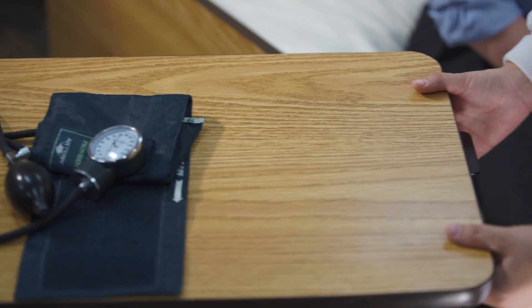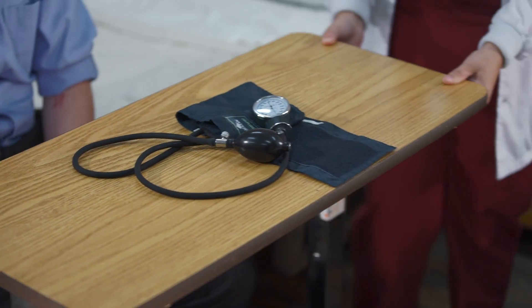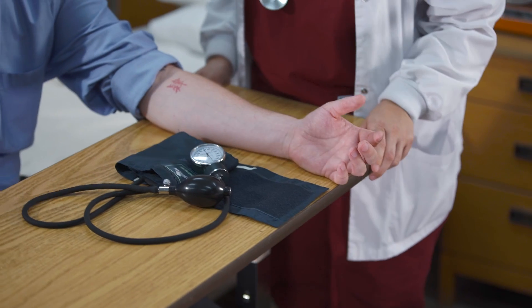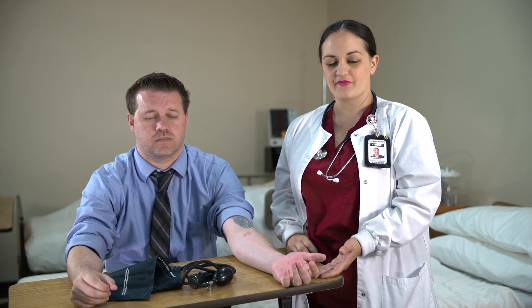Once all the considerations are taken, while the client is sitting, make sure the client's bared arm is resting on support so that the midpoint of the upper arm is at the level of the heart. Extend the elbow with the palm facing upward.